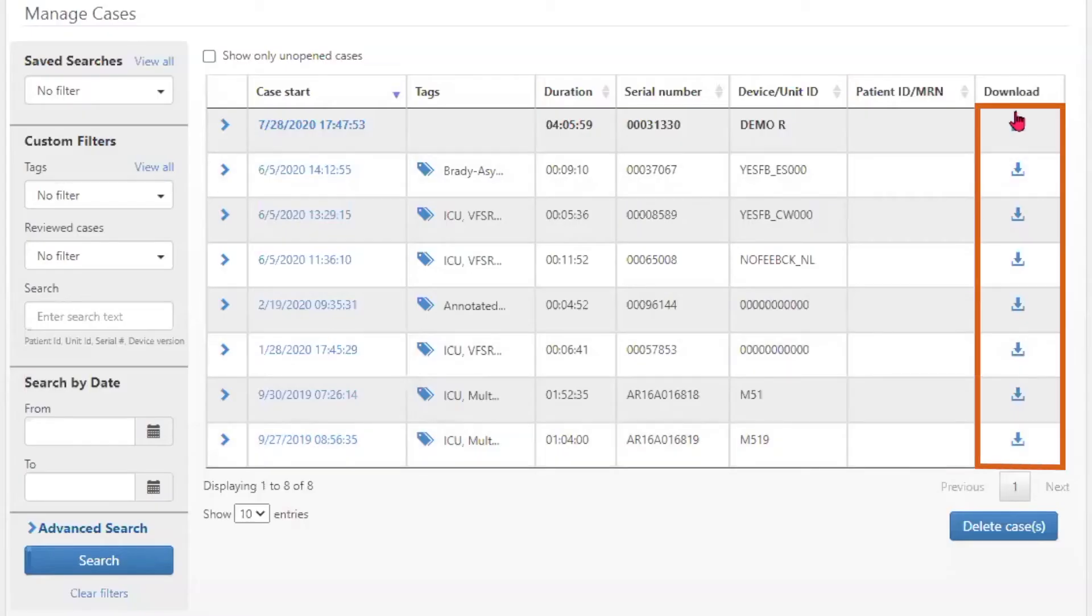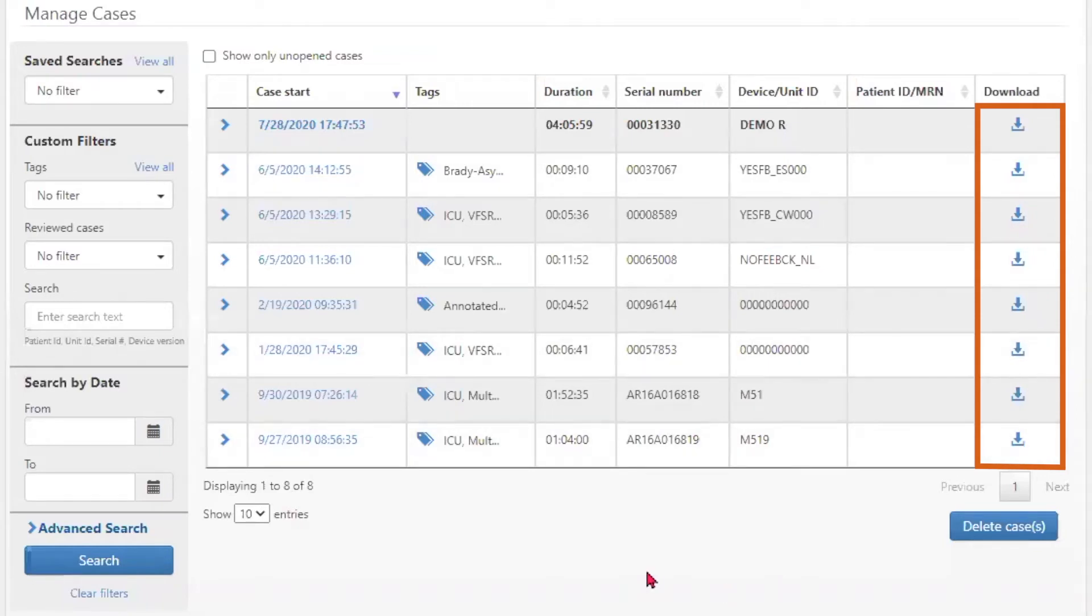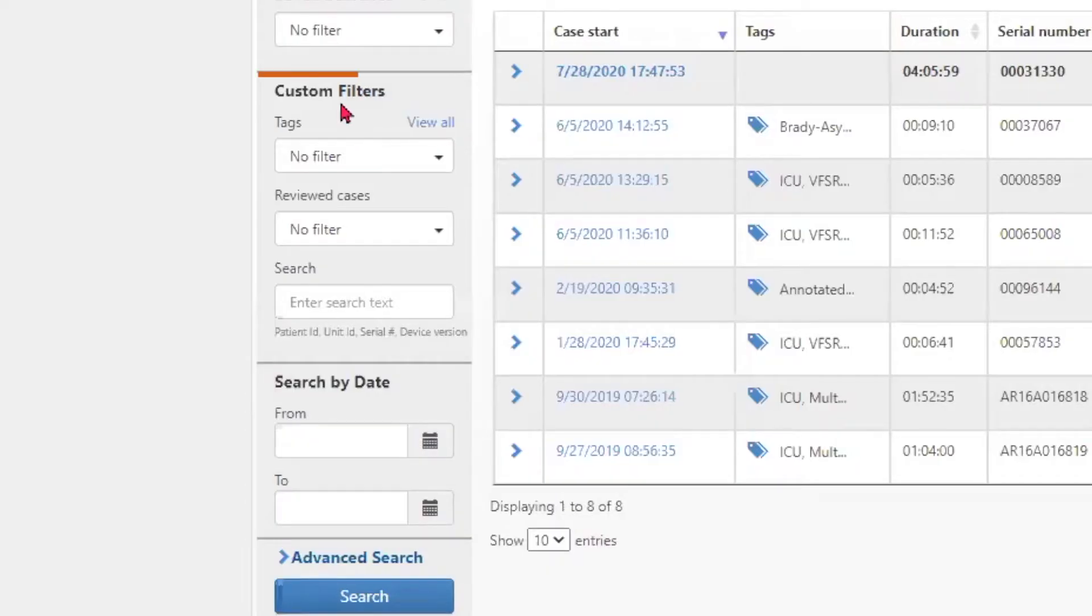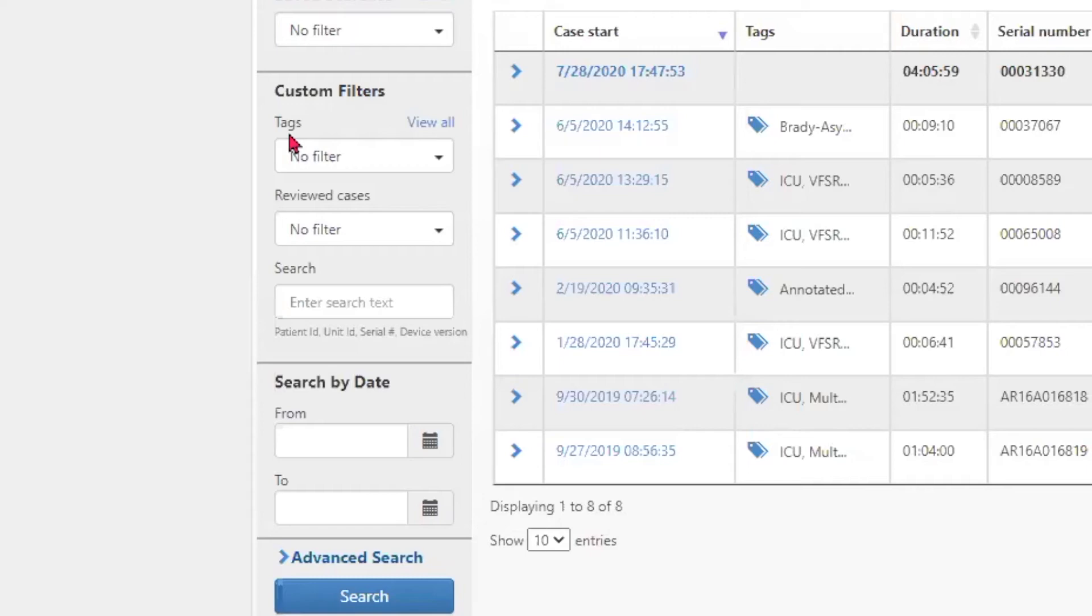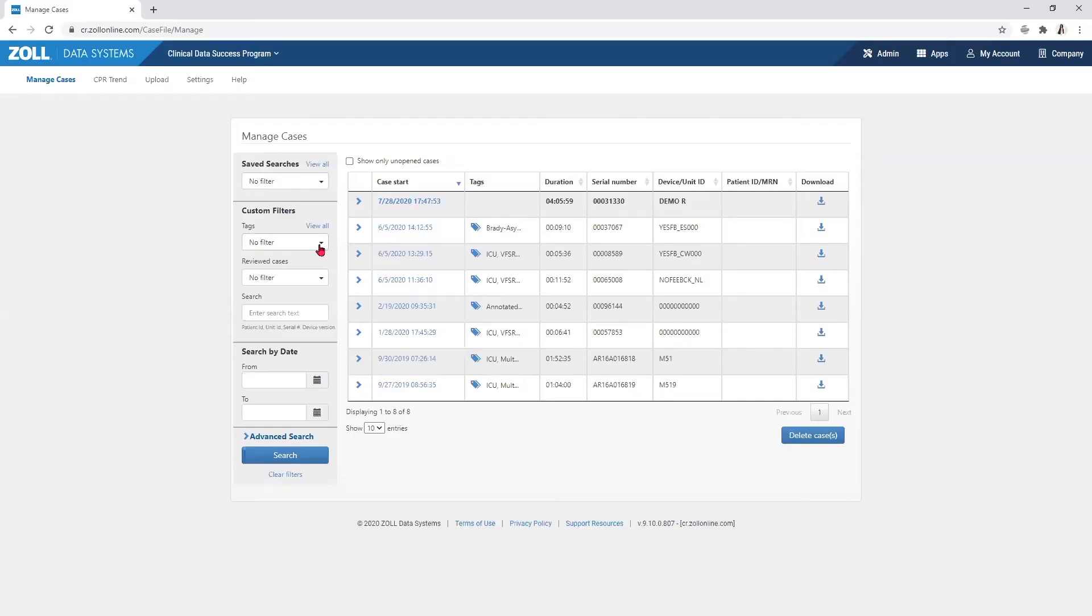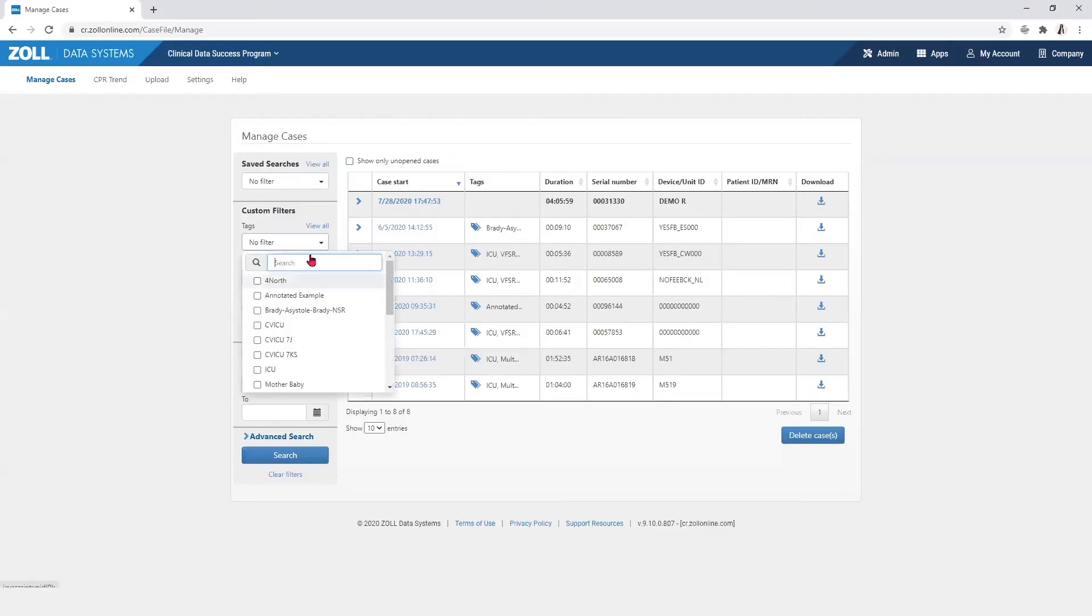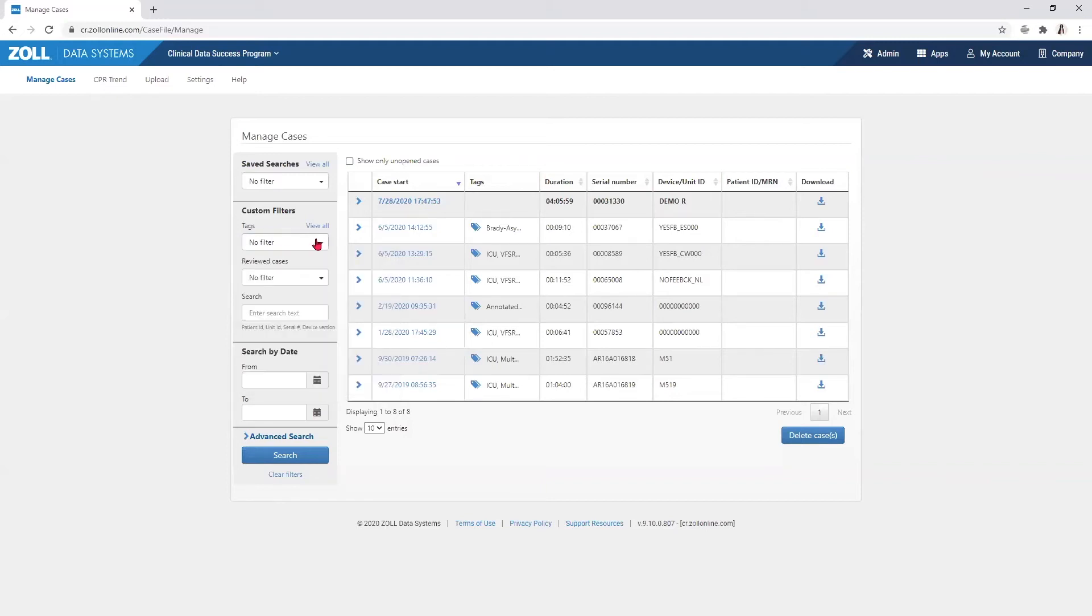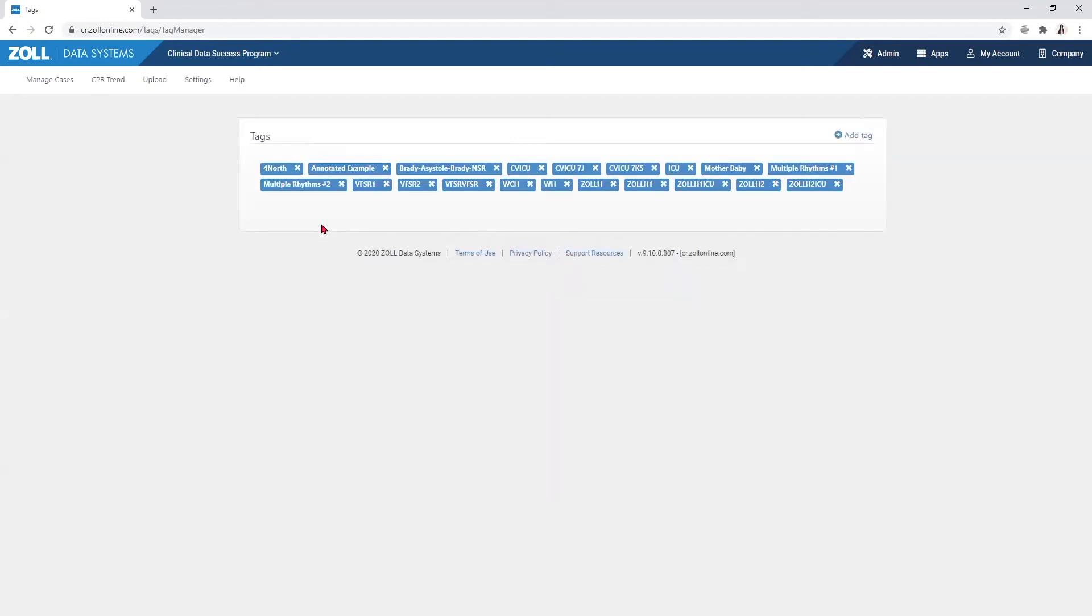Files can be downloaded from the Manage Case pages using the arrows in the download column. Custom filters allow the user to find specific cases within the database. If tags have been added to the case, the tag filter allows you to find those cases. You can view all tags that have been created in the database by selecting the view all blue identifier next to tags.